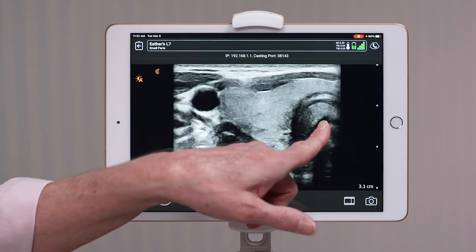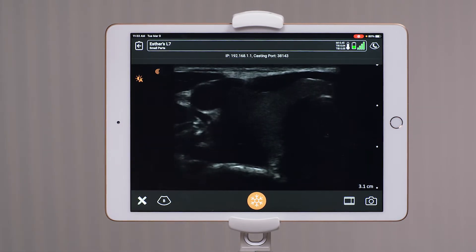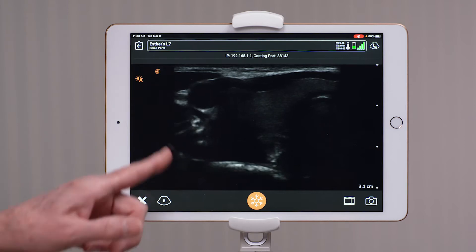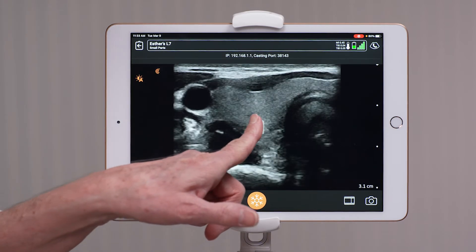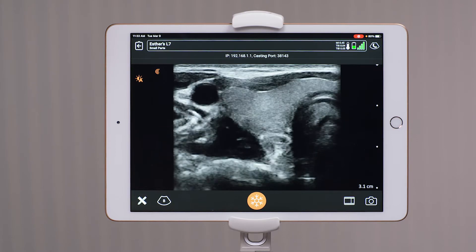To clear that up, I swipe to the left, but now as you can see, I'm under gained and you can't see any of the information. So you want to be sure that your overall gain is set to center so that you have a good brightness to see the area that you're scanning.